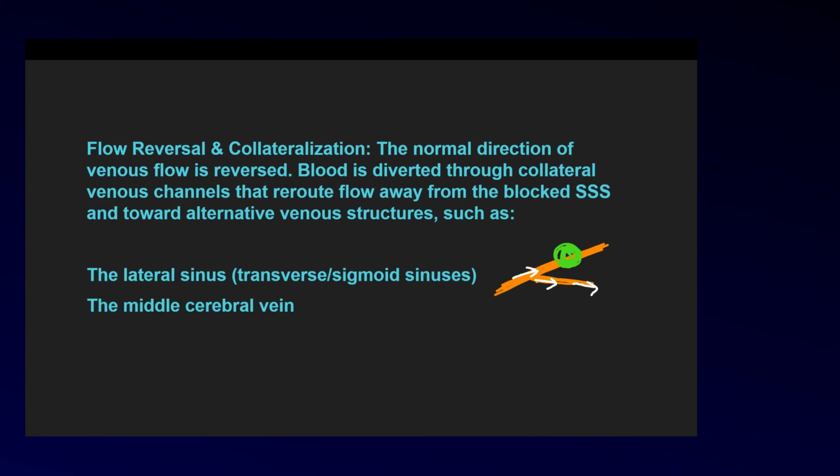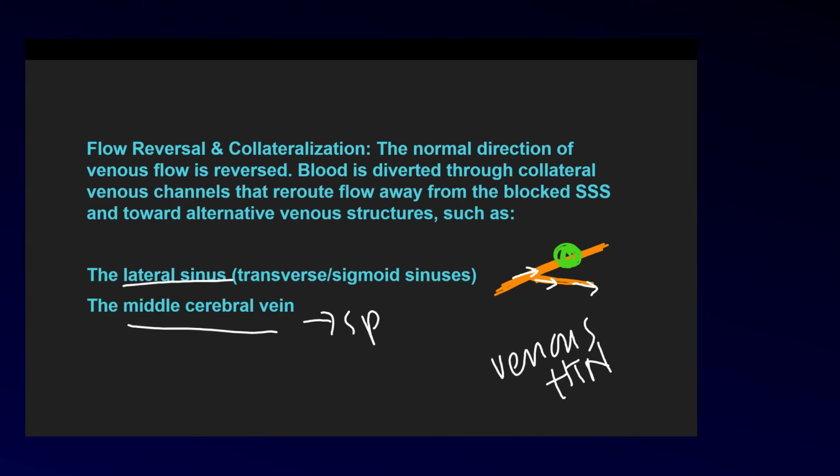Sometimes this works as a life-saving thing because it is also channeling the blood. Other times it can end up in the patient having venous hypertension. We are going to address venous hypertension as well, inshallah. So apart from that, we discussed that we want to see where the blood is getting shuttled down, if it is the transverse sigmoid sinus route, if it is the middle cerebral vein and the sphenoidal route.